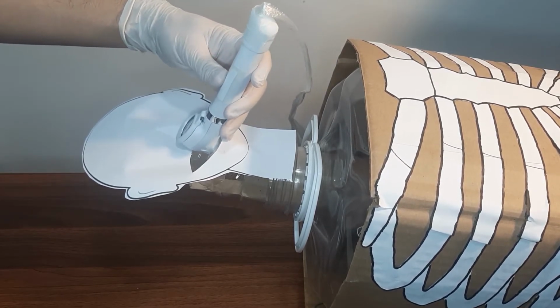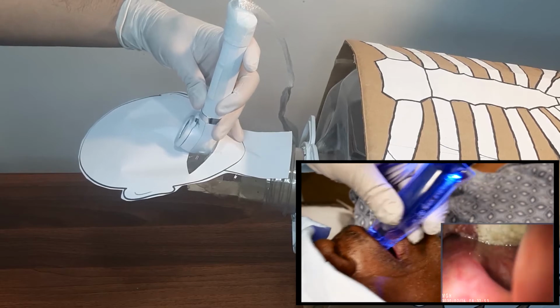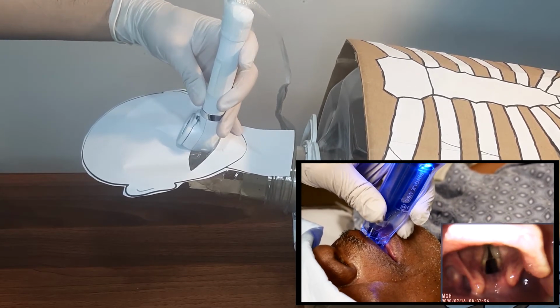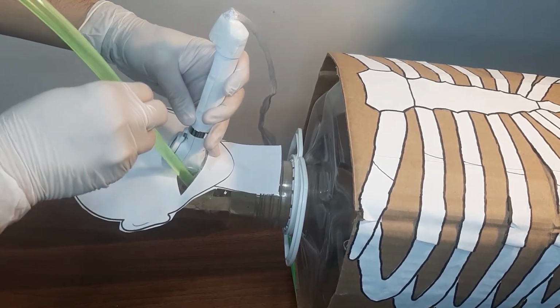Traction is then applied along the long axis of the handle, and the jaw and tongue are pulled forward and up off the rest of the face in order to give view of the vocal cords. The blade should not be levered on the teeth as a fulcrum. When there is massive aspiration, bleeding, or inability to identify the vocal cords, apply suction.